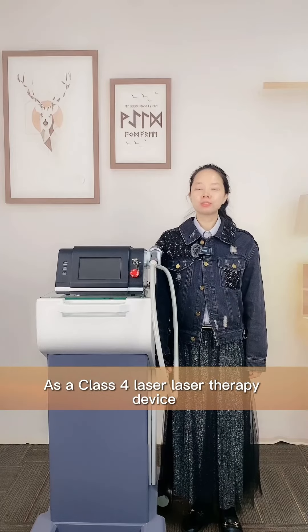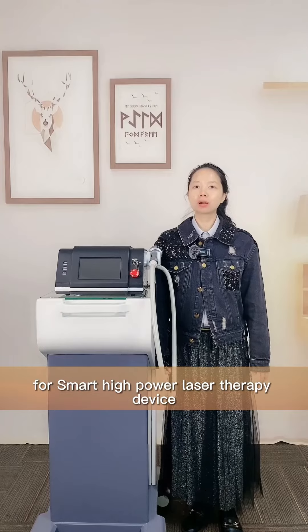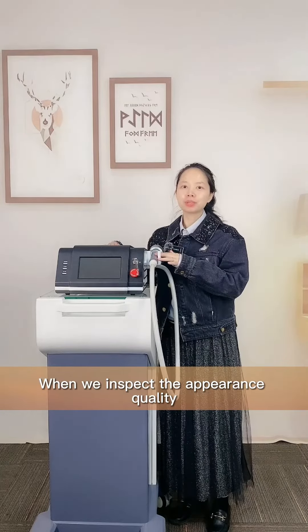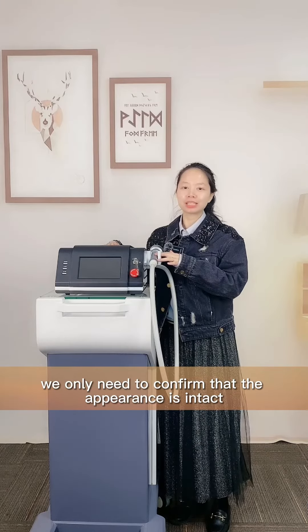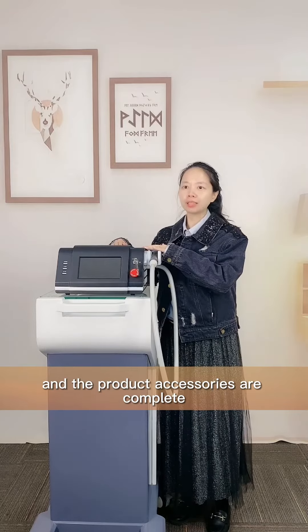As a class 4 laser therapy device, how do we do quality inspection for our smart high power laser therapy device? When we inspect the appearance quality, we only need to confirm the appearance is intact and the product accessories are complete.